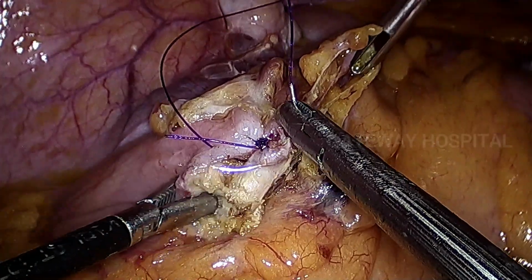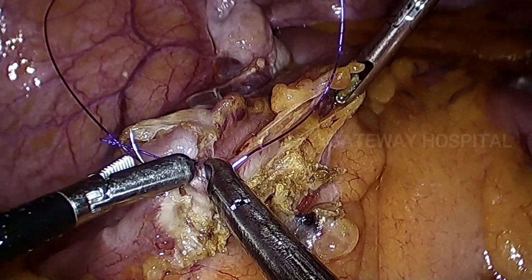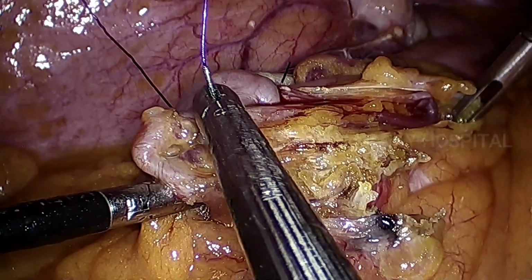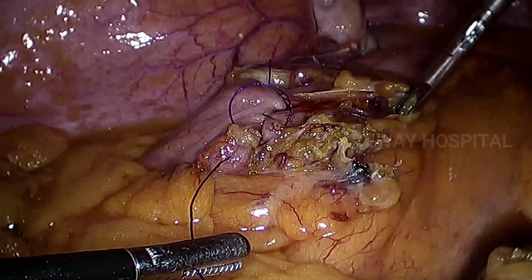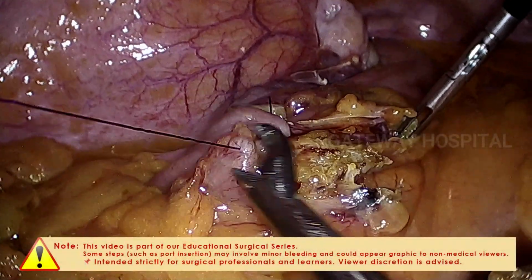And another important point during excision is you should not breach or rupture the capsule of the tumor. Sometimes it will be a very friable tumor. So you have to use extreme caution in order to prevent rupture of the capsule of the tumor, so that there will not be any recurrence in the post-operative period.